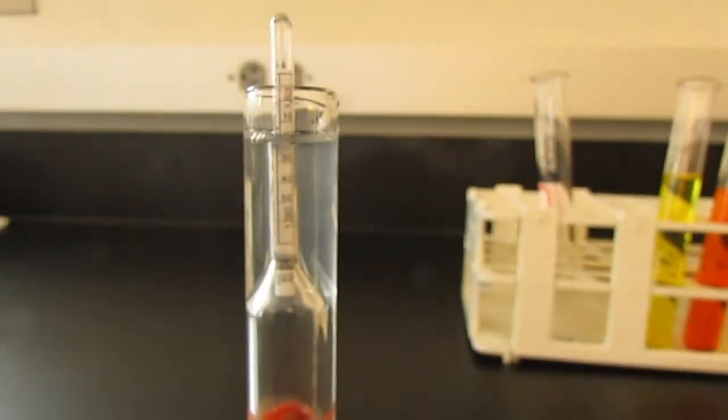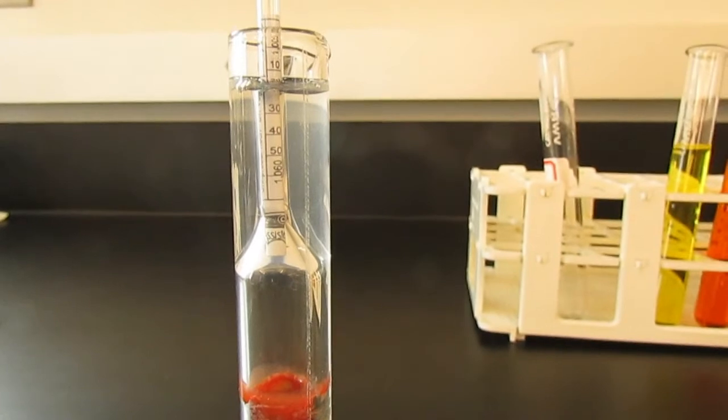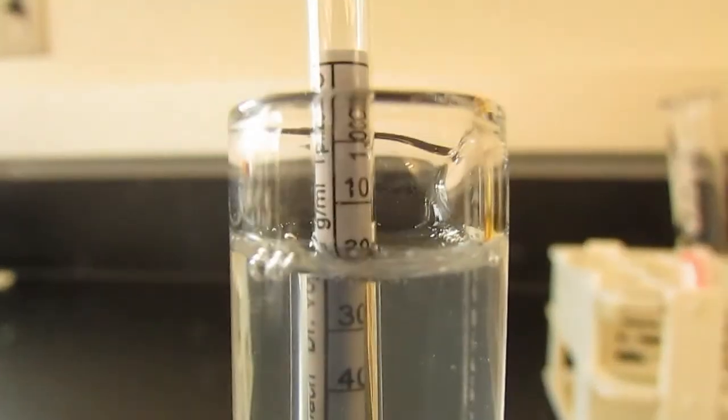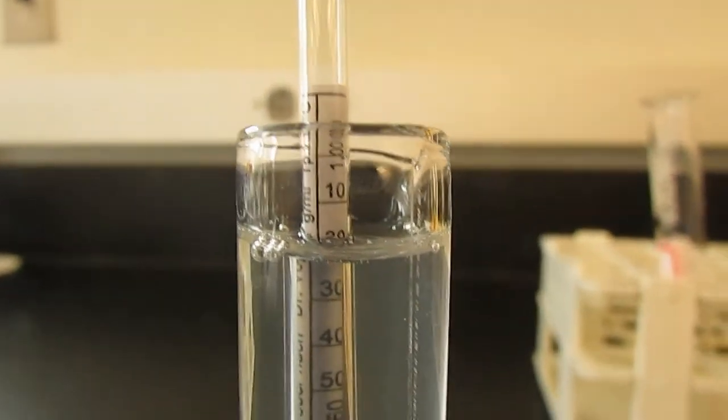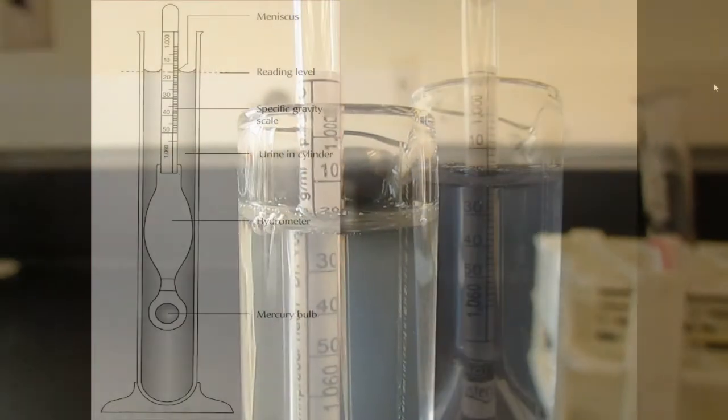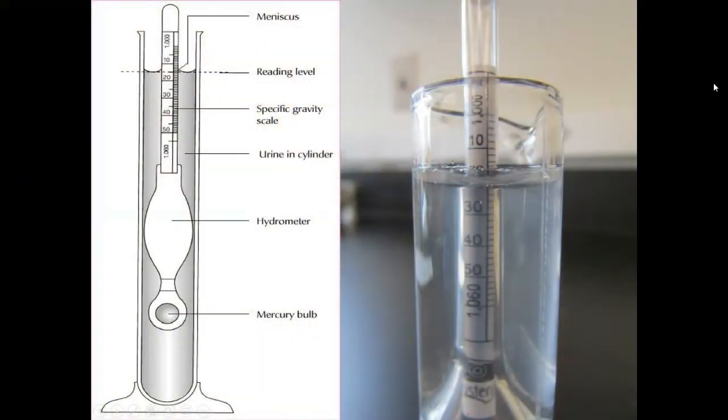even higher. Okay, so what you're about to see in this video is photographs of this right here for all of the samples for you to measure and determine the specific gravity of each of these urine samples. Okay, so now we have seen me complete one of these exercises, but I do want to talk just a teeny bit more about this hydrometer, okay, and exactly how we read it.